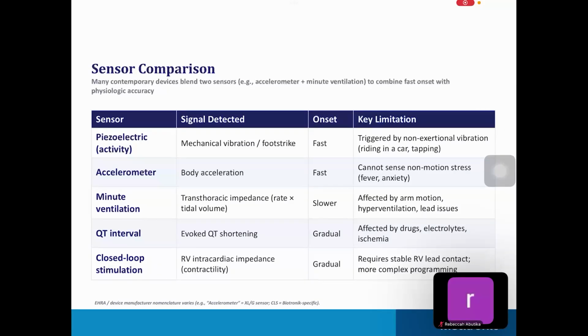If the patient reaches a lower rate of 70 or 60 beats per minute, it will pace at a rate of 95 or 100 for 1 or 2 minutes to protect the patient from vasovagal syncope. This is called the rate drop response feature.